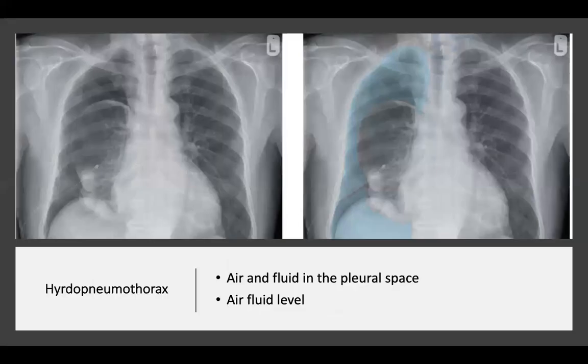That was an example of hydropneumothorax — air and fluid in the pleural space. An erect chest x-ray will show an air-fluid level, with the horizontal fluid level usually well defined and extending across the whole length of the hemithorax. Causes may be iatrogenic (such as introduction of air during pleural fluid aspiration or chest drain insertion), trauma, or the presence of a gas-forming organism. The images show a right-sided hydropneumothorax with the pneumothorax marked in blue, the pleural fluid in green, and the air-fluid level shown by a black dotted line.